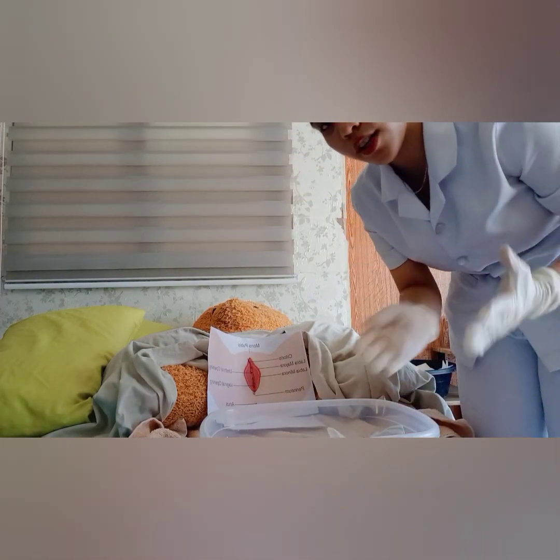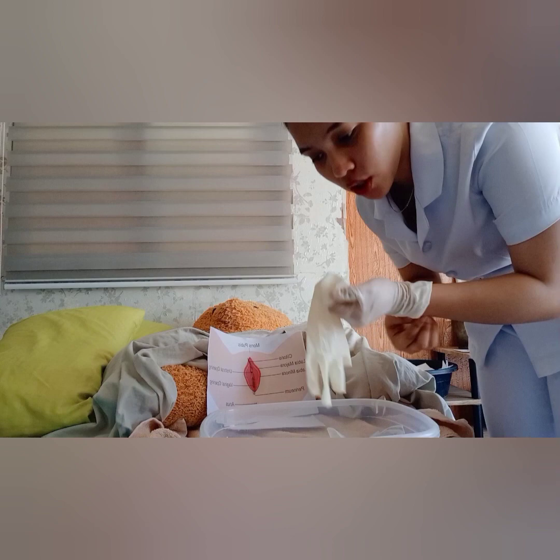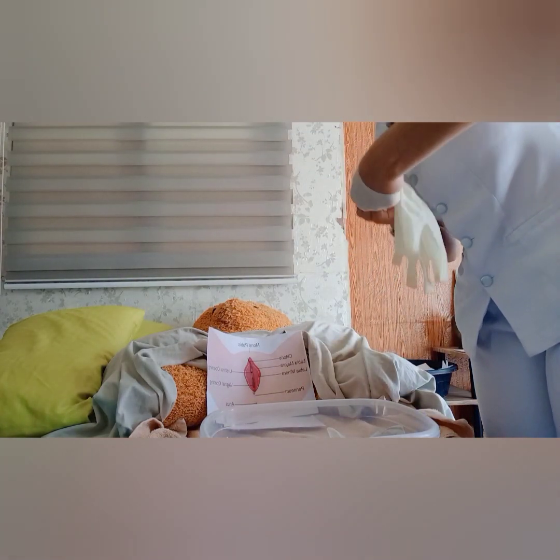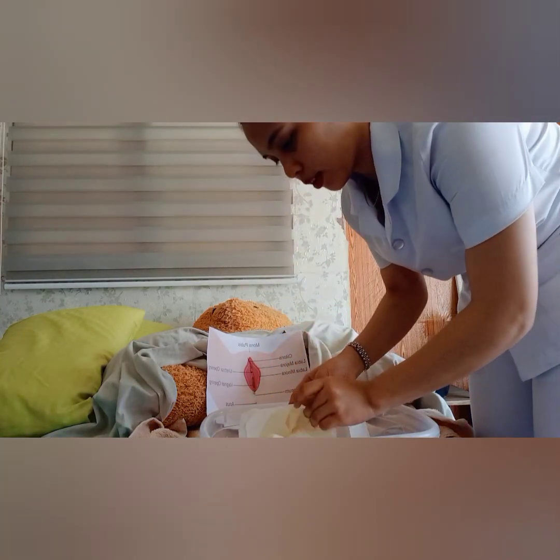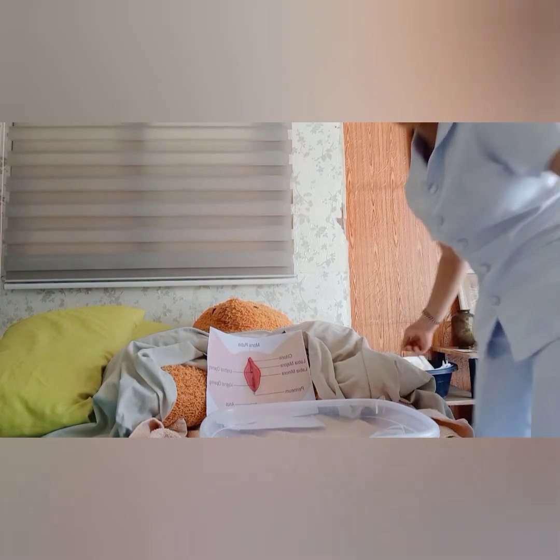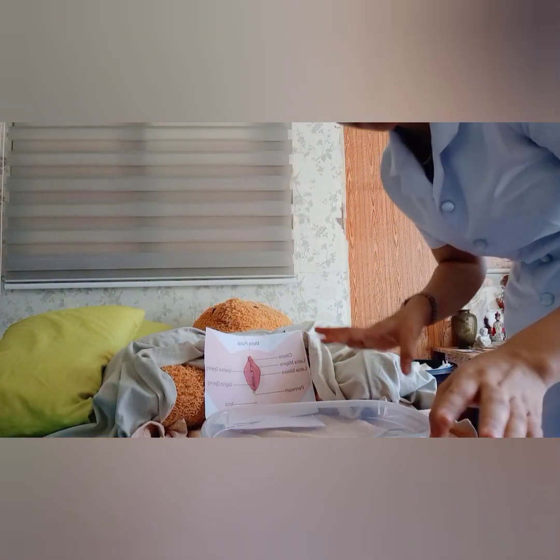My gloves are now unsterile, so I'm going to remove my gloves and apply another pair to perform the catheterization. Okay. And we are gonna dispose of our gloves properly. The next step is to open the set, observing sterile technique, and put on another pair of gloves. Okay.